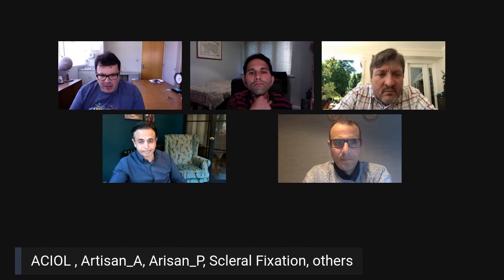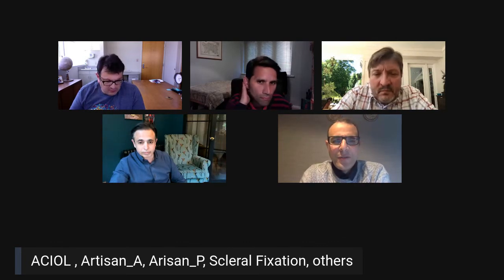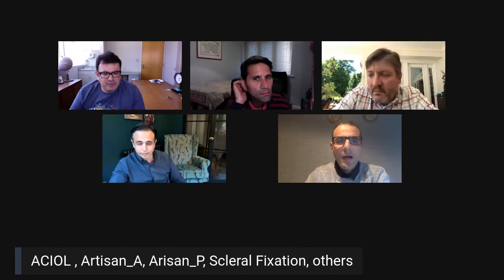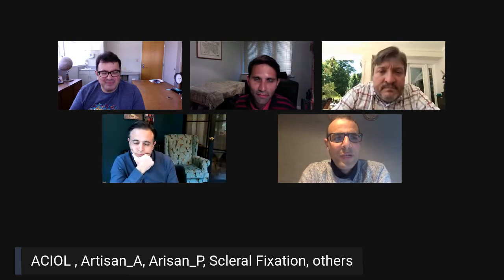Right. And Abdallah, what do you do? Do you use AC IOL still? Oh, you're muted, Abdallah. Abdallah, we cannot hear you. You're muted. Oh, sorry. Actually, I stopped doing them about 5-6 years ago because now we have many more options than in the past. So I usually go to a retropupillary Artisan or a scleral fixated lens.